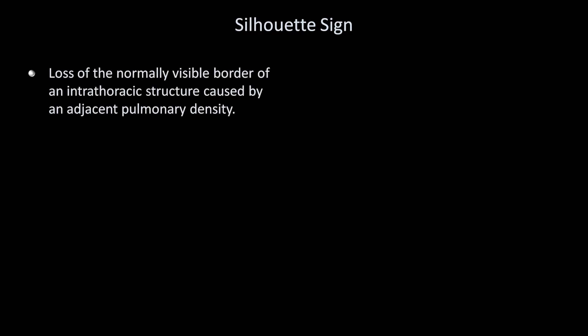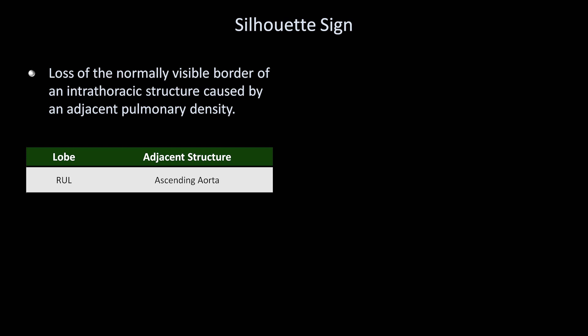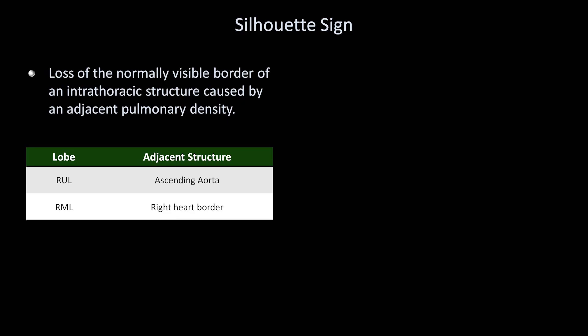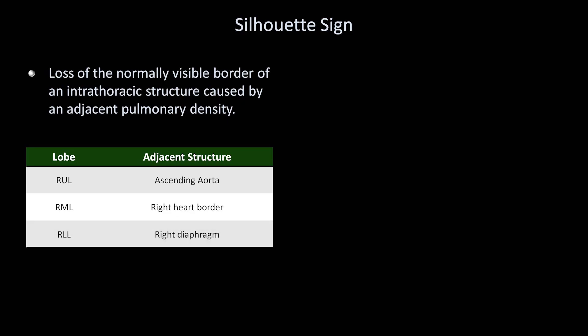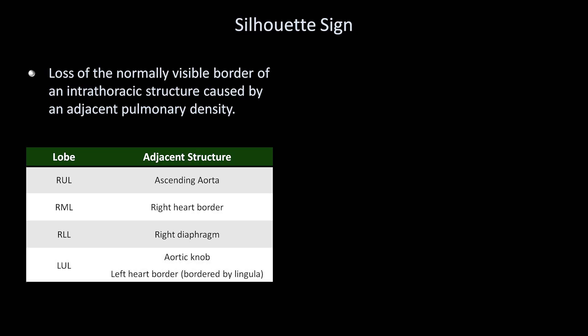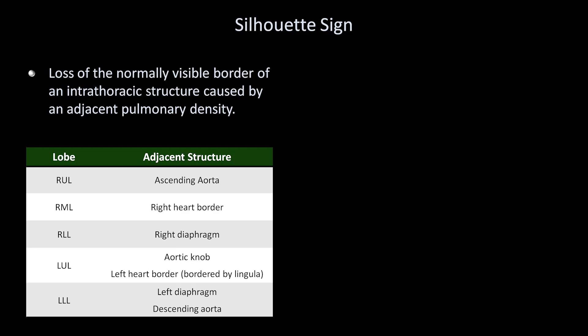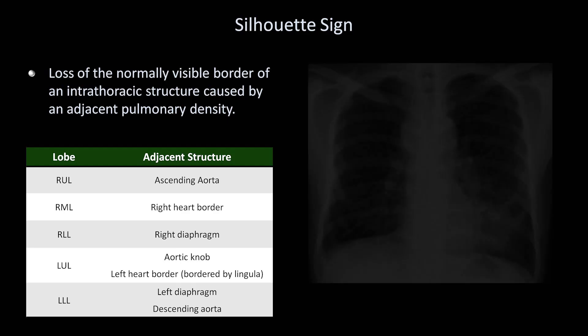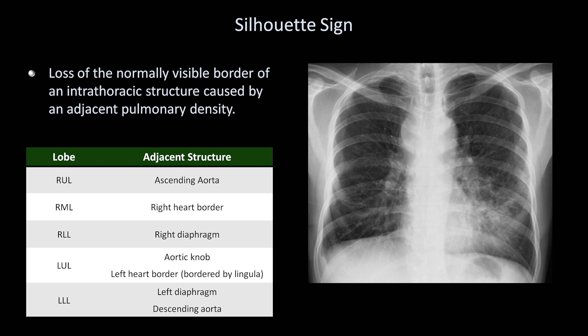When identifying and localizing an opacity, there are two helpful radiographic signs. The first is the silhouette sign, in which there is loss of the normally visible border of an intrathoracic structure caused by an adjacent pulmonary density. A density in the right upper lobe can obscure the ascending aorta; a right middle lobe opacity obscures the right heart border; the right lower lobe obscures the right diaphragm; the left upper lobe can obscure the aortic knob and/or the left heart border — specifically bordered by the lingula; and a left lower lobe opacity can obscure the left diaphragm and/or the descending aorta. In this example, it's the left heart border that's obscured, so the opacity is located in the lingula.